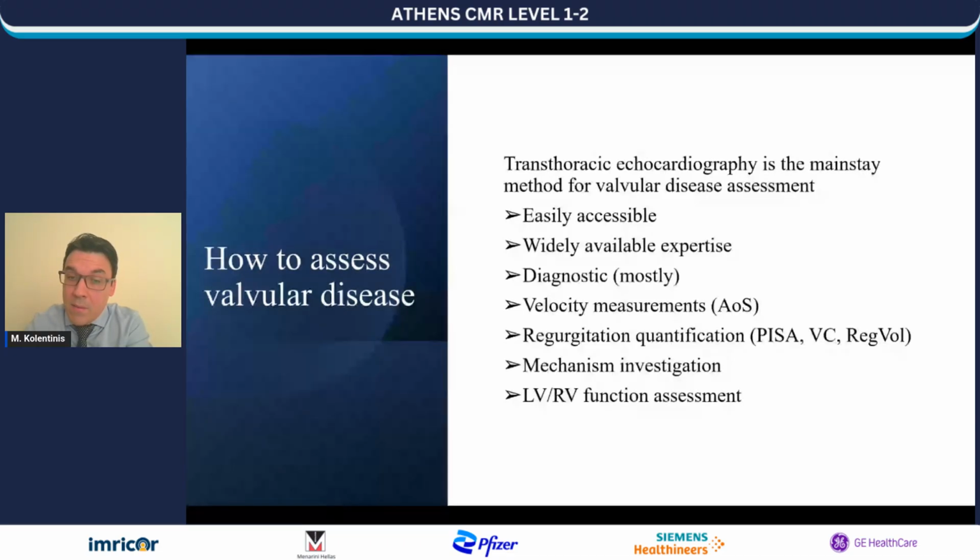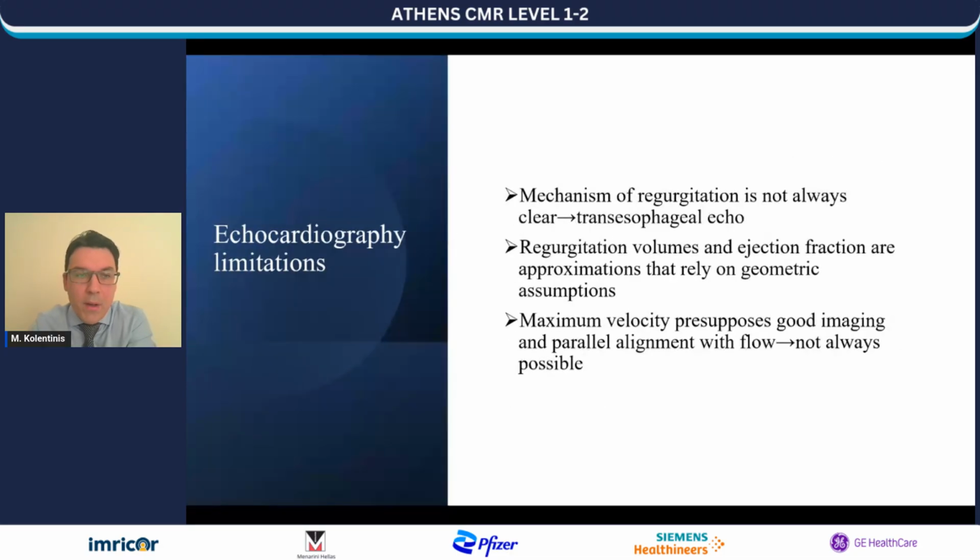The mechanism of regurgitation especially is most of the time clear, and also you can assess left and right ventricular function, especially with the new methods such as 3D echocardiography. But as every method, echocardiography has its limitations.